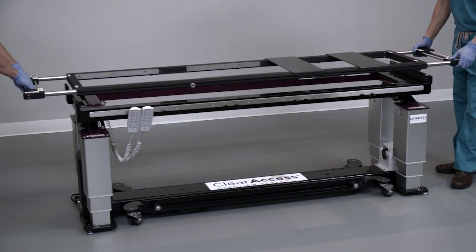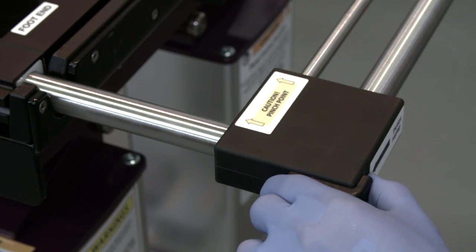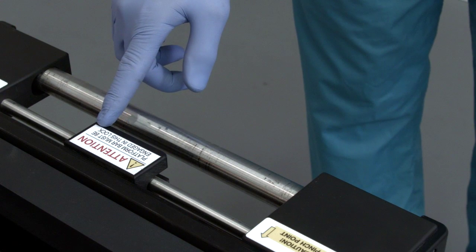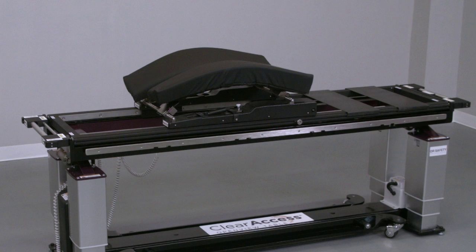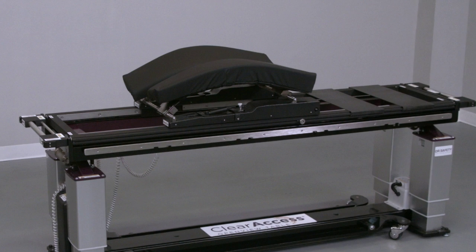Once the prone platform is completely seated, depress both thumb releases at each end of the table to collapse the handles into the platform. Collapsing the handles at the foot end locks the prone platform into the base. The Clear Access FlexFrame spine platform is sometimes generically referred to as a Wilson frame.